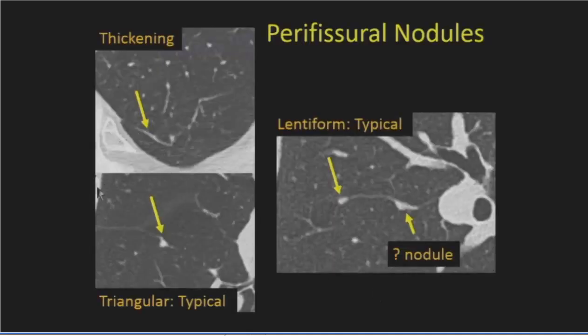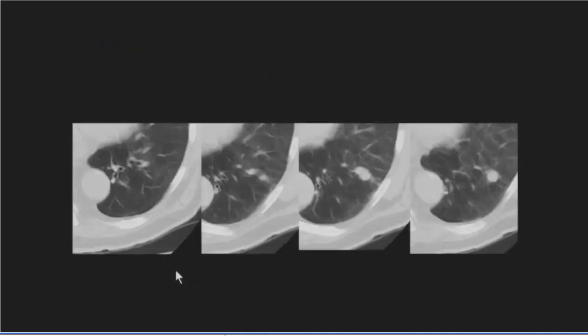And here are some examples of nodular densities. This perhaps is just thickening, which we do see. This is one of those which you might debate as a nodule, but has obtuse angles regardless, probably not significant. And these are the two areas that would be characterized as a typical perifissural nodule, abutting the fissure on one side with mildly obtuse angles and/or polygonal structure.